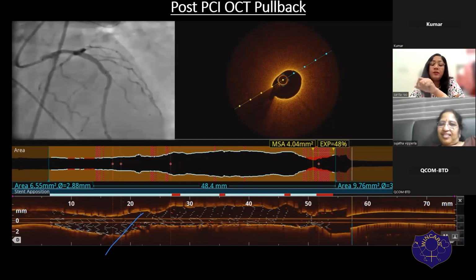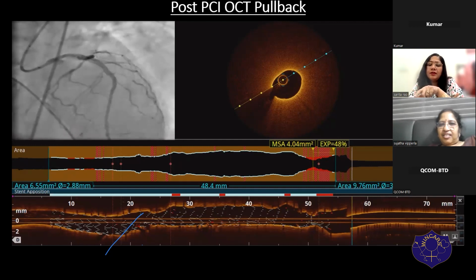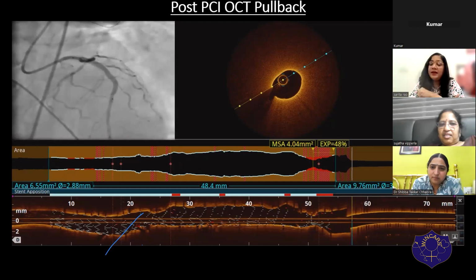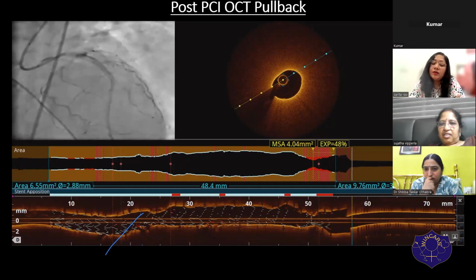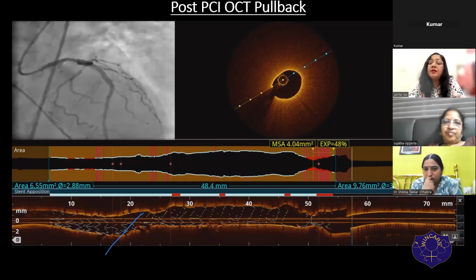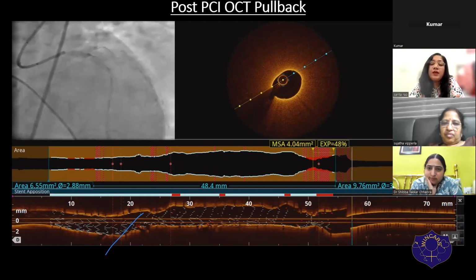Second question, Dr. Shiba, very important. You asked about upfront temporary pacing. Yes, that is again important. You are very right. Many times when I rota, I take upfront LV dysfunction. If I'm doing LAD or RCA many times, and I'm rotating, I try to put in the TPI, or at least I take a venous access.